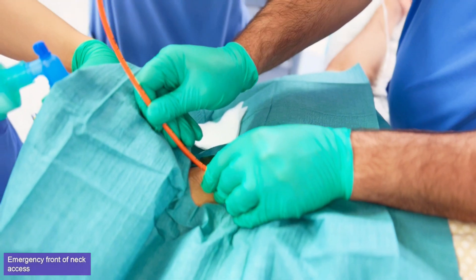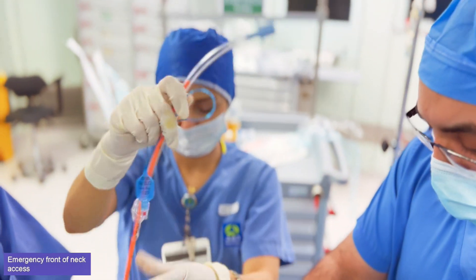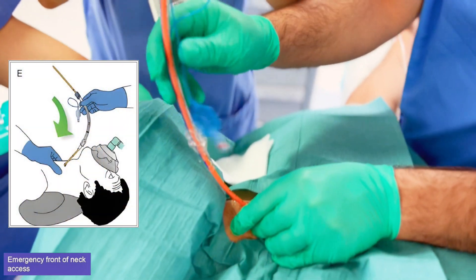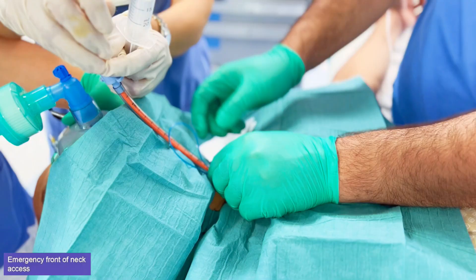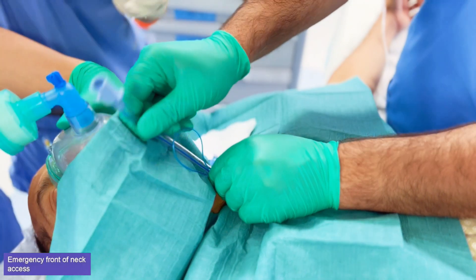Advance the size 6 tracheal tube into the trachea by continuously rotating the tube as you advance it. Try to avoid excessive advancement of the tube, then remove the bougie.